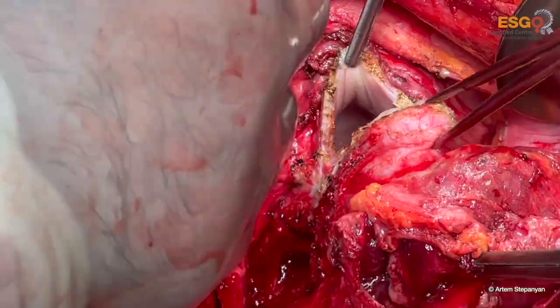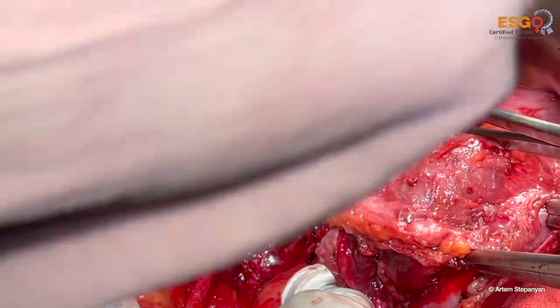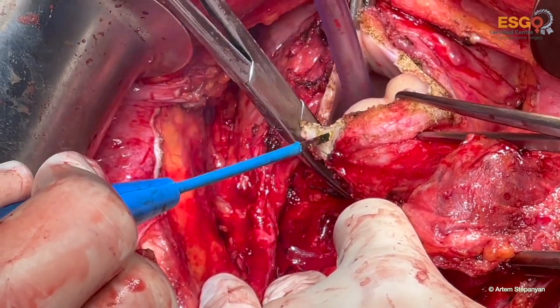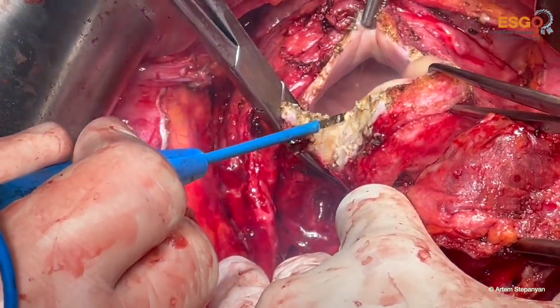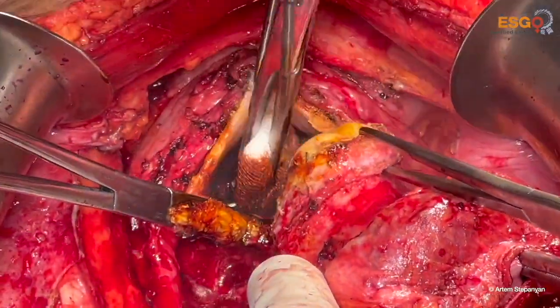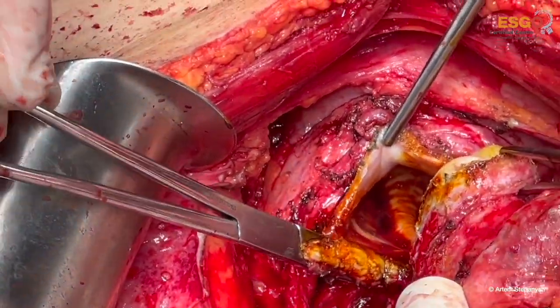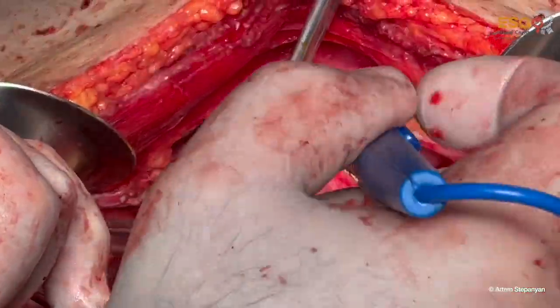Here we see the vaginal lumen. So we put the Rogers clamps on the lateral vaginal fornix together with vessels and cut under direct vision of the ureter and rectum. The vagina is open. We put some betadine. And the same is done on the opposite side.